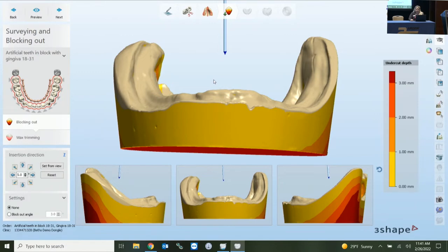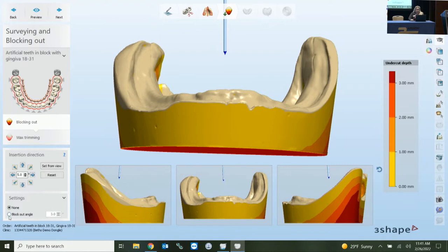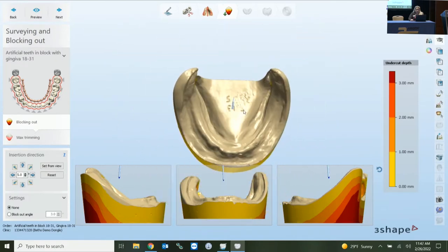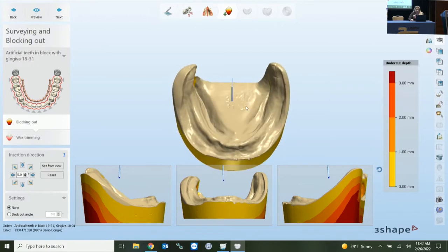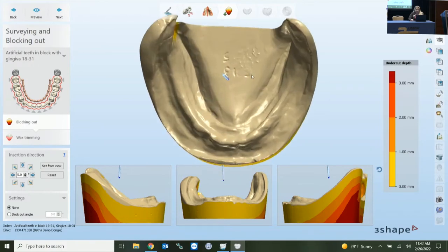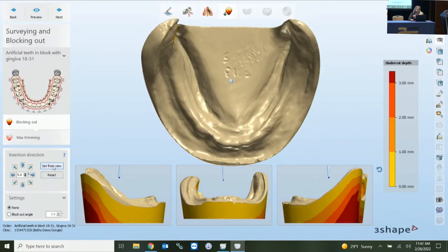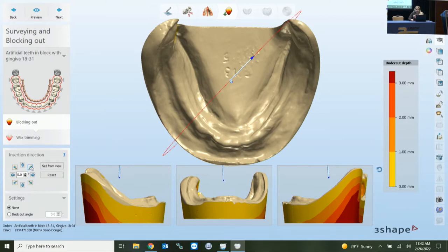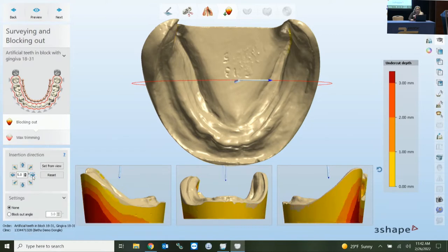In 3Shape, the default for digital dentures is to not block out — it's set to none by default. You can choose a global block-out angle and adjust it to block out automatically, or manually block out as technicians are used to. You can adjust your insertion path two ways: rotate with your right mouse and set from view, or use the arrows on the left to move in specific degrees — one click moves five degrees in that direction.